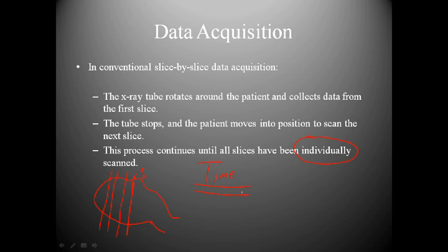And then when you have a patient that will not cooperate, time seems to stand still in the CT suite, especially if you're by yourself. Basically, slice by slice gives the patient enough time to move in between the slices and really mess up the scan. And so that is why there is a huge shift to volume or helical slice acquisition.